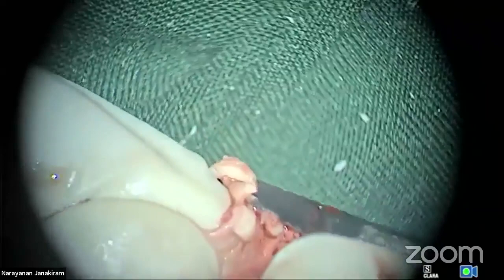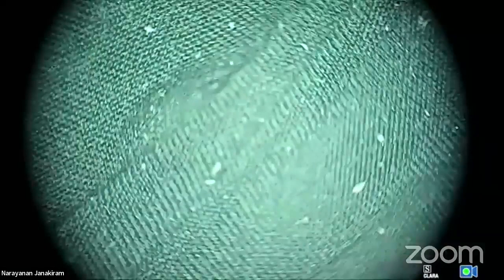Using a little perichondrium along with it, because now this also goes. Take that. Now I can keep another cartilage just to stabilize it, these two small pieces. I'm done. Right, sir. Now I go. Put him on.